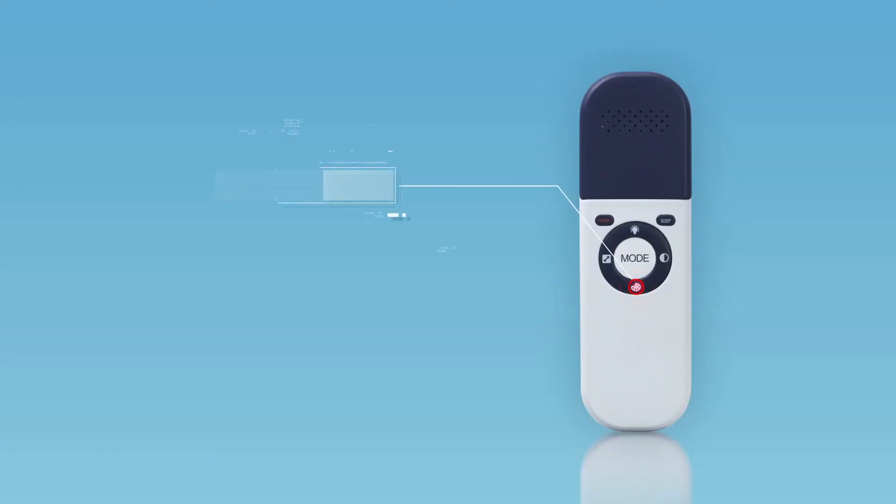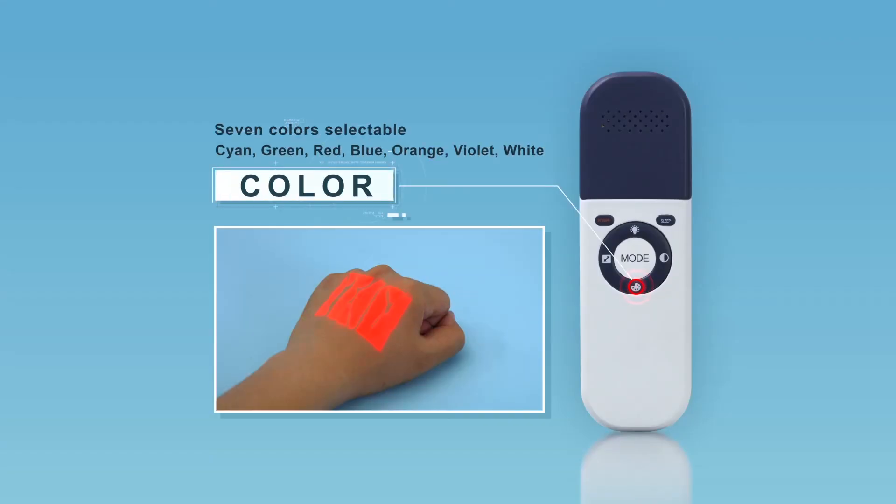Seven colors are available to meet the individual requirements of medical staff and different scenarios. You can change the color by short-pressing the Color button.